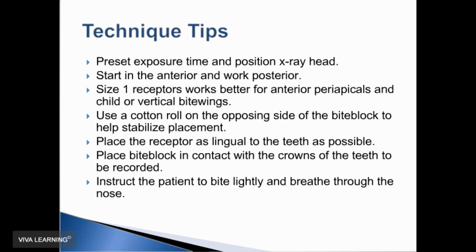Especially with digital receptors in the rigid type, it's important to place the receptor as lingual as possible to the teeth. You'll get your best and more parallel placement this way. I always like to just set the placement and have the patient bite to hold or maintain my placement rather than having the patient bite it into place. I find that that doesn't work very well.